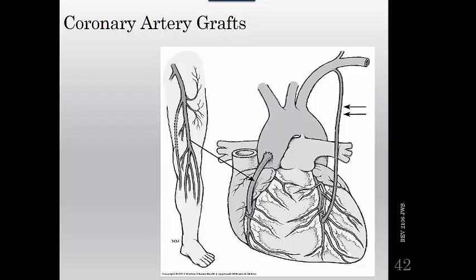Other techniques for opening these arteries are balloon angioplasty and coronary stenting. They're less invasive than CABG, and they are options for some patients. Angioplasty is a technique that's used to dilate an area of arterial blockage using a catheter with a small inflatable sausage-shaped balloon at its tip.